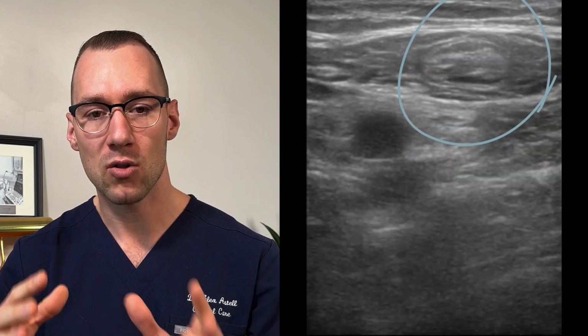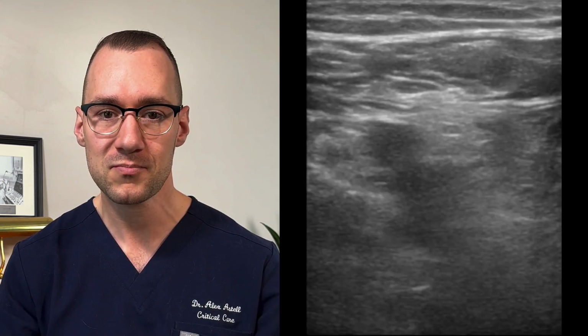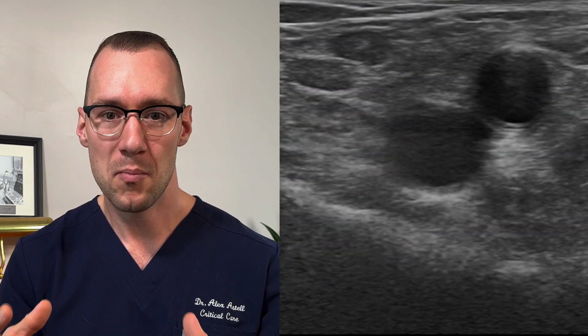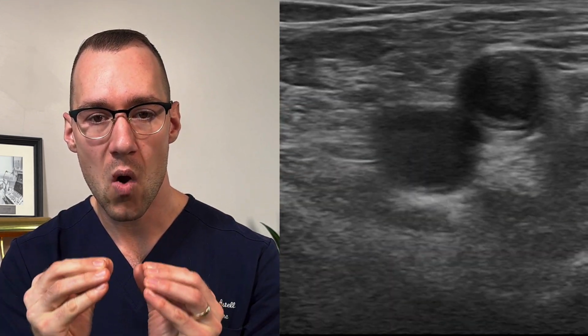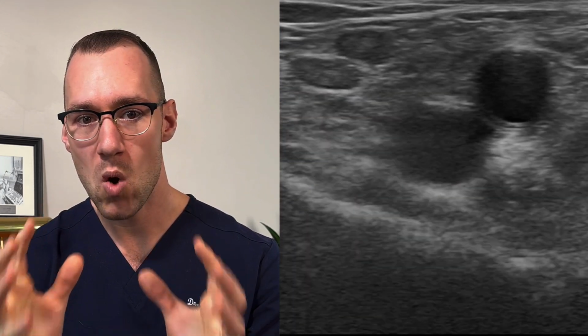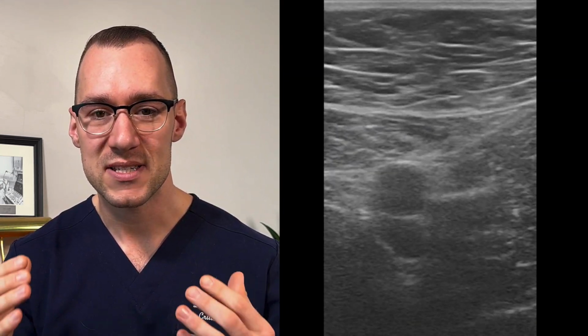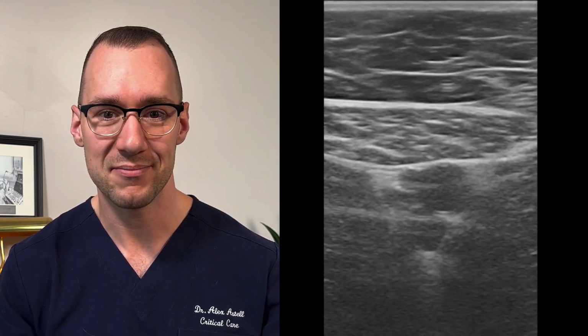Now we know how to perform a DVT study, it's important for us to be mindful of common mimics of DVTs. Muscle bands may appear alongside the vessels as rounded, well-circumscribed structures. Lymph nodes can sometimes take on the appearance of clots, but are themselves discrete structures. They often have a hyperechoic center and a hypoechoic periphery. The most important thing is to assess for continuity with the venous system when scanning up and down the leg.